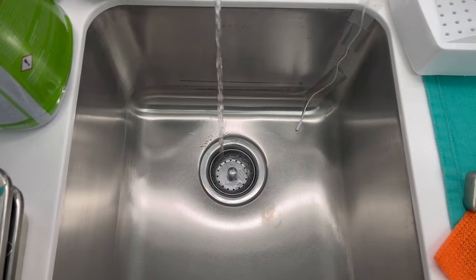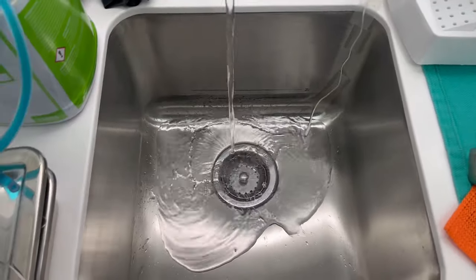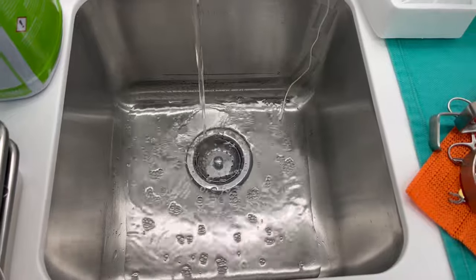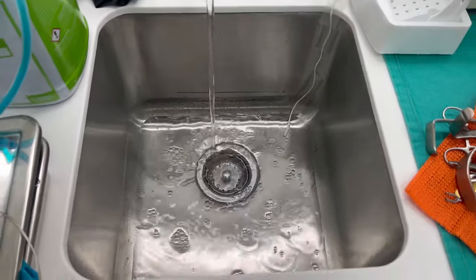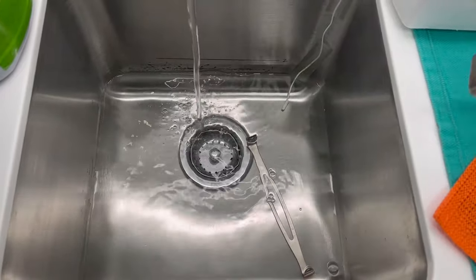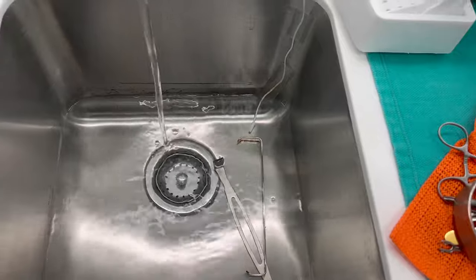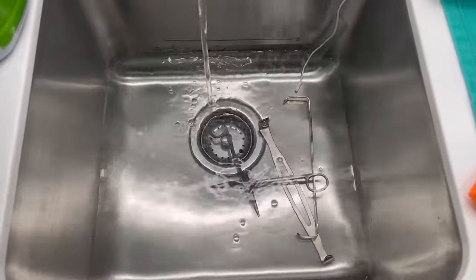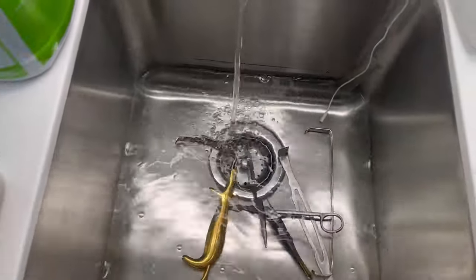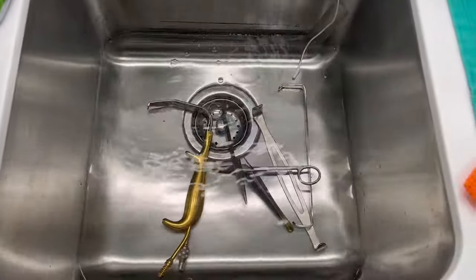You basically just follow the instructions for how much of the, what is it called, the liquid we use to decontaminate the instruments. Making sure you're using the right amount. I soak the instruments for a while. If they're really bloody, I'll soak them for a while with the, why can't I figure out the name of this thing that we use to decon them with? But anyways, I'm responsible for doing this.